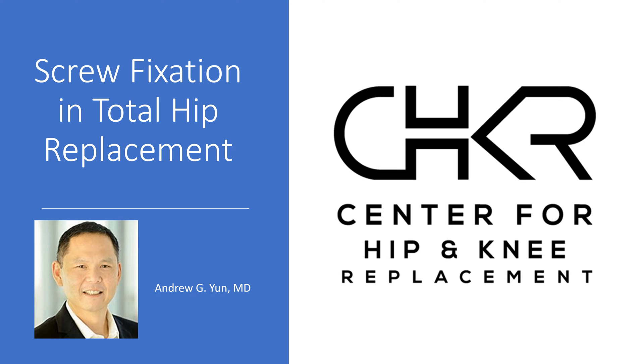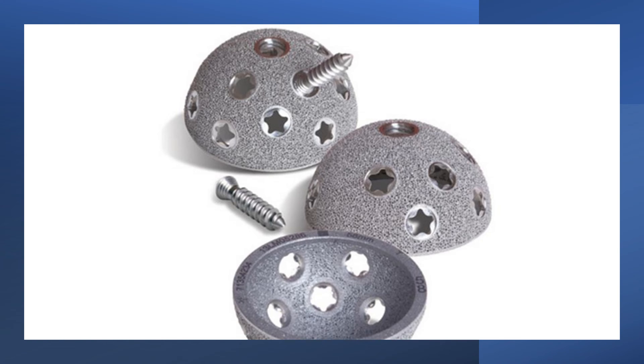I'll talk a little bit about our thought process as well as the radiographic appearance of screws. Here we're looking at the outer or external aspect of an acetabular component. There's an inner aspect into which a polyethylene shell will go. This is the concave area of the acetabular, but this convex part goes into the pelvis. We see two main things: a roughened sandpaper-type surface — this macro texture is what the bone of the acetabulum will grow into to create a biologic interlock — and little holes through which a screw can be placed to increase fixation.